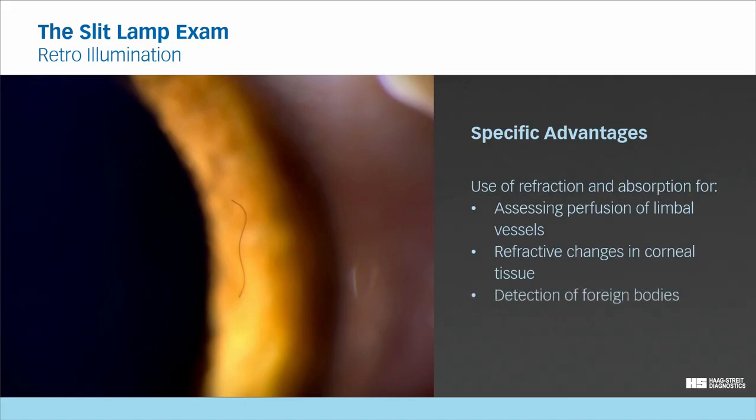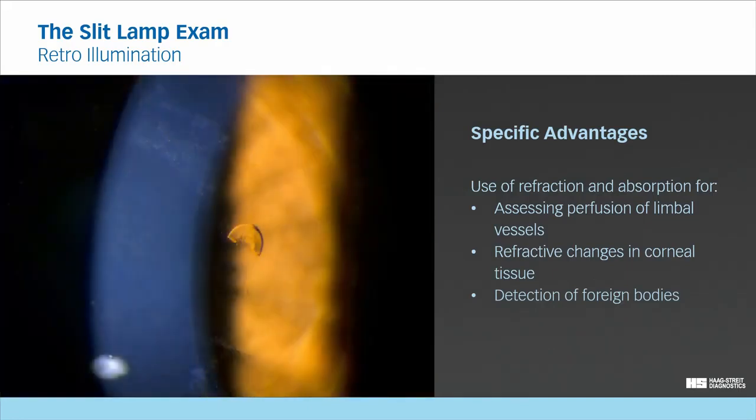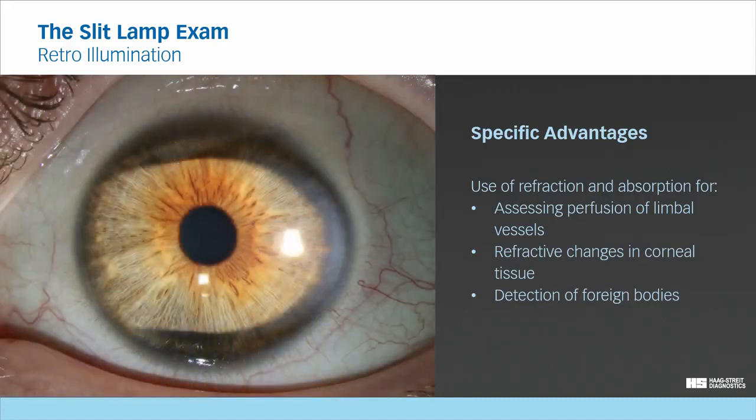When assessing a non-transparent foreign body embedded within the transparent corneal tissue, the foreign body will appear dark, as it absorbs the light rather than transmitting it. A transparent foreign body, however, may also refract, but not fully absorb the reflected light. Finally, the absorption-transmission phenomena allows you to detect transillumination phenomena of the iris using the red reflex from the retina.